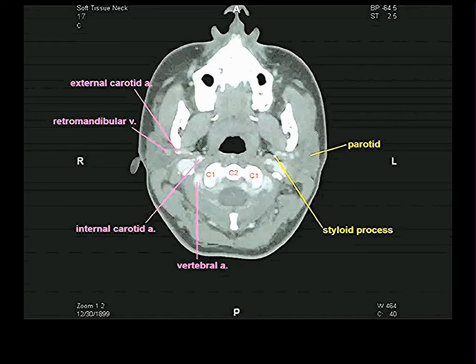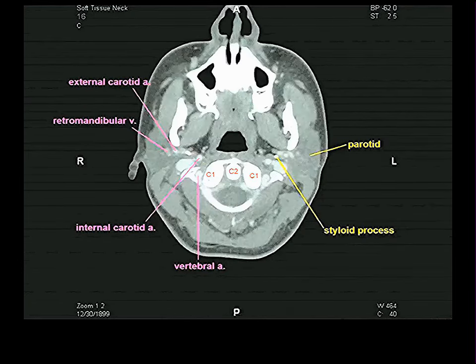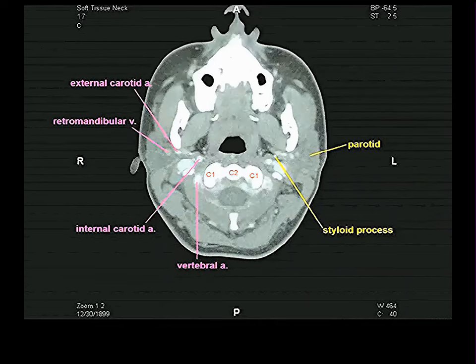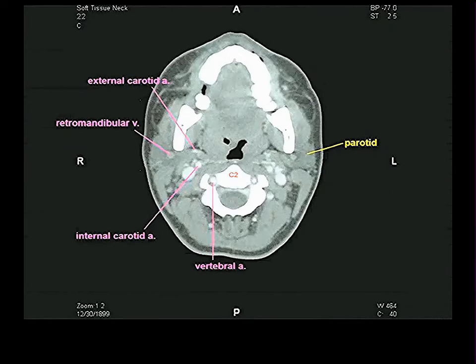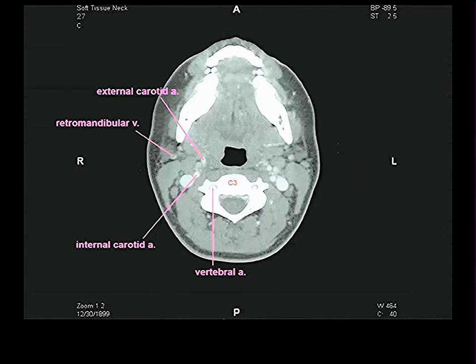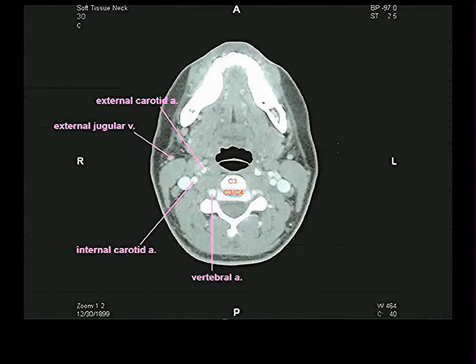There's another, this is the parotid gland. You've seen it even though you haven't dissected it. That little mucky stuff there is the parotid gland. Also running in the parotid gland, lateral to the external carotid artery, is the retromandibular vein. If we follow this retromandibular vein back down the neck, it's what's going to give rise to our external jugular. This is still parotid gland here, retromandibular, and now it's on the surface of the sternocleidomastoid, having become the external jugular.